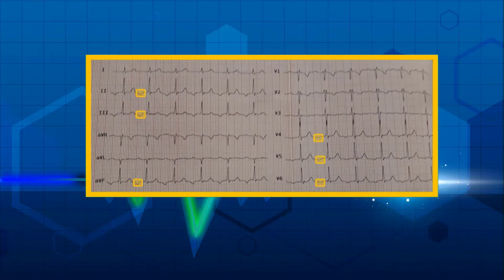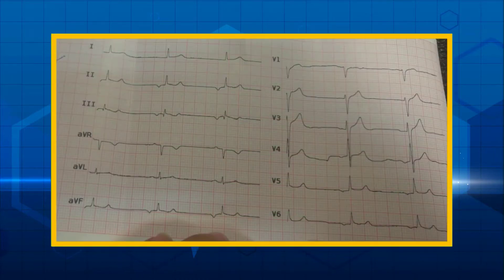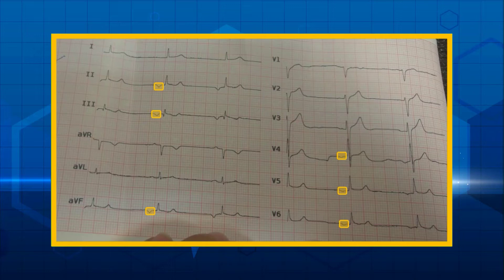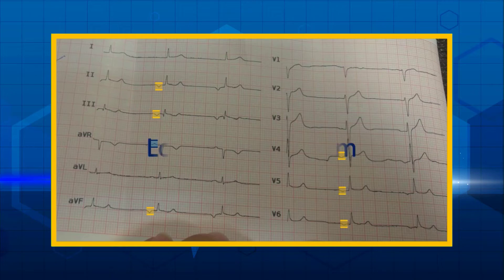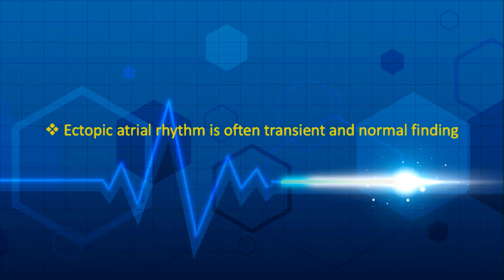In the next example, the P waves are inverted in D2, D3, AVF, V4 to V6, and upright in AVR — therefore the P waves are non-sinus and from the low atrium. The heart rate is nearly 90 beats per minute, so this is low atrial rhythm. In the following example, the strip shows the same pattern: P waves inverted in D2, D3, AVF, V4 to V6, and upright in AVR, with a heart rate of nearly 57 beats per minute — also low atrial rhythm.